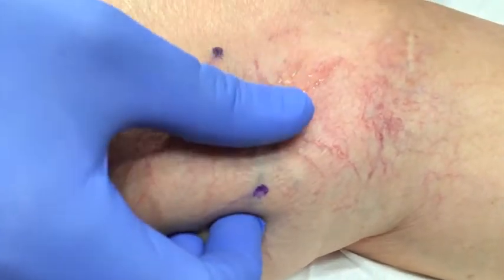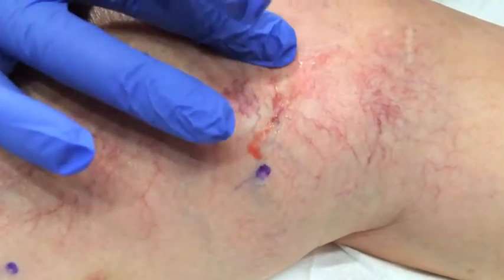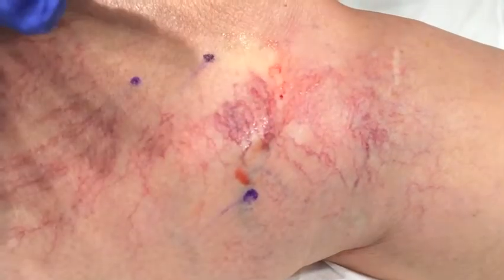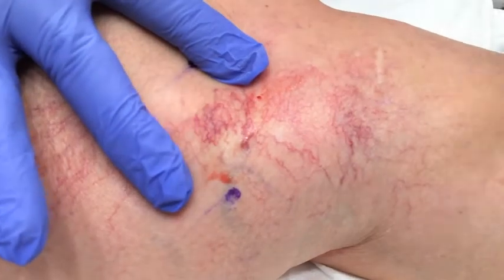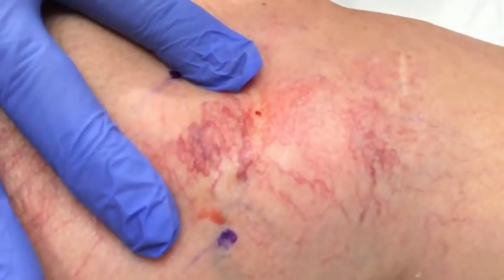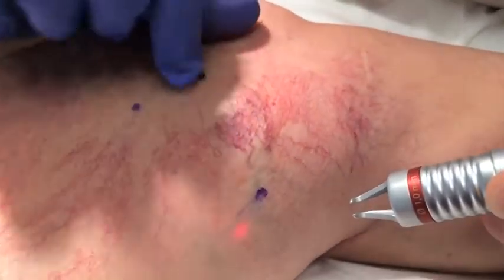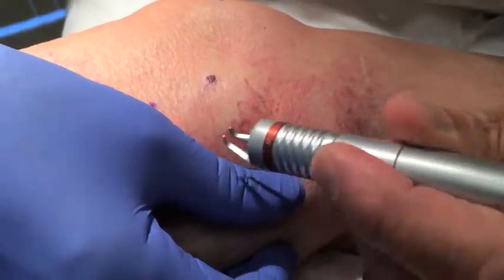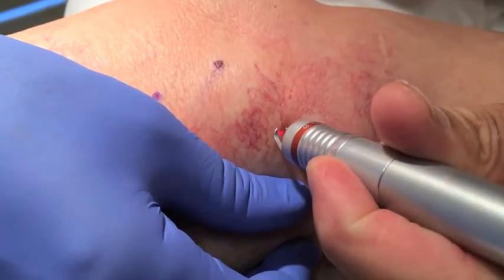Another trick is to empty the blood like this. So we'll empty the blood and actually laser the vessel with the blood emptied — that helps too. You can see it's filling up; I empty it and do the laser with it empty. She has a nice subdermal technique here of local anesthetic. I'm going to empty the blood just a little bit to make the lumen a little bit smaller — I empty it just gently like that, and then we laser.